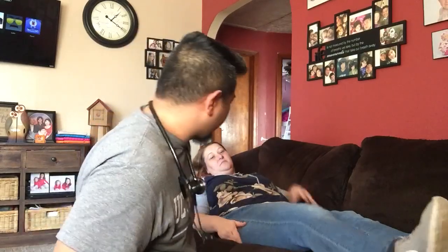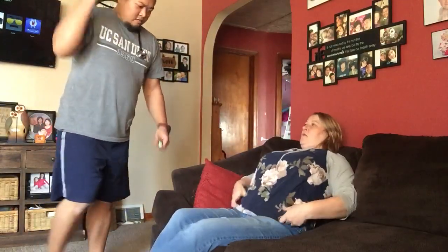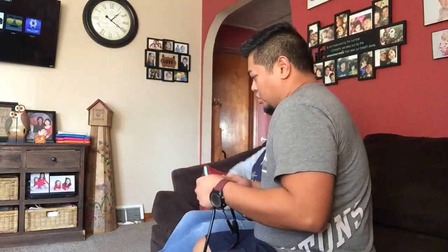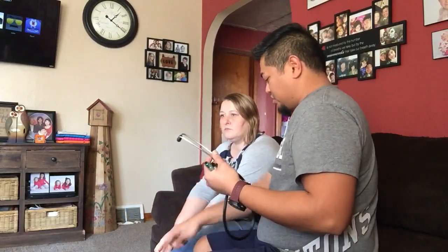Next thing we're going to do is have you sit up. If you can sit up for me, please. Now for patients or residents, especially in long-term care, while you're checking for lung sounds, you check for any skin breaks on the back, the coccyx, and the heels. Actually, I should have checked the heels earlier too, but I'm going to listen to lung sounds. Take a deep breath for me.